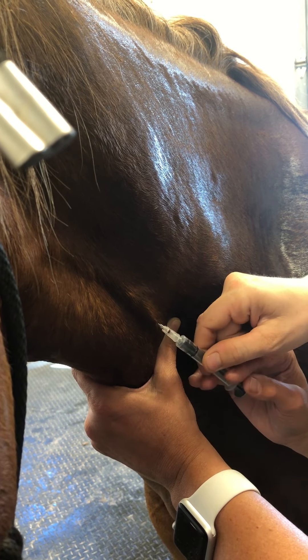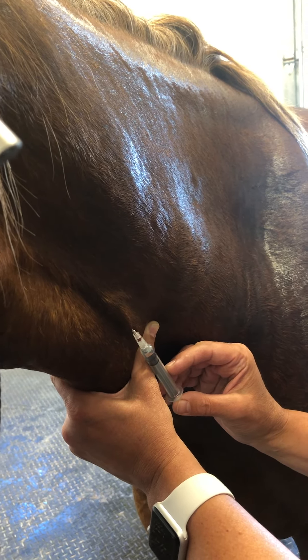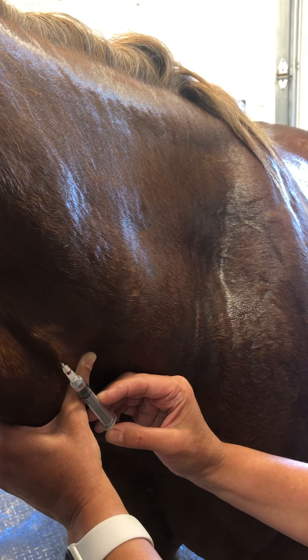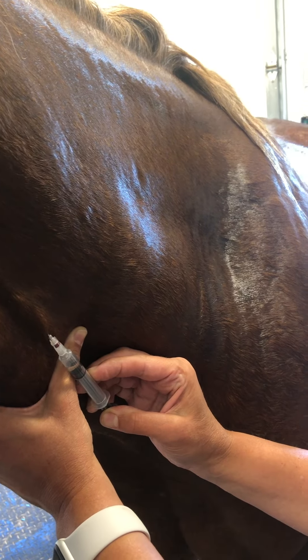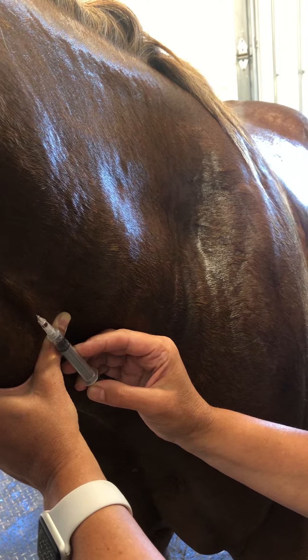Redirect a little bit this way. We're gonna do our video, so why don't you start. You're still shallow, so you should get just a flash of blood.